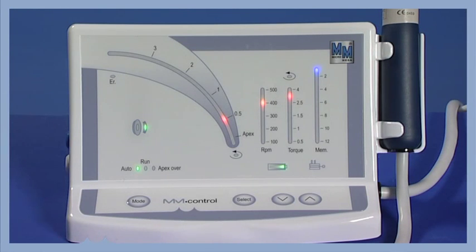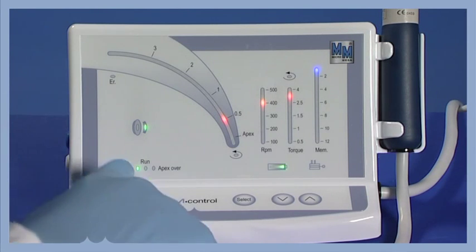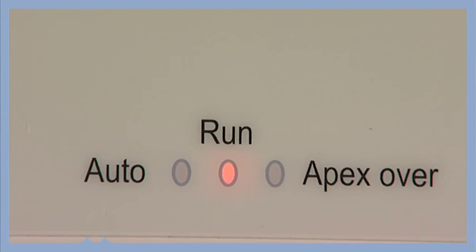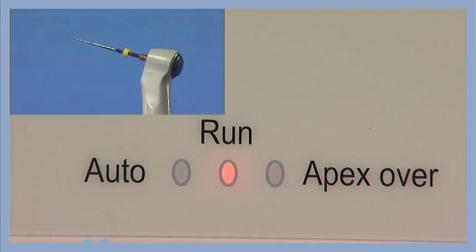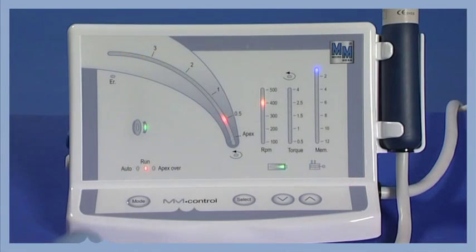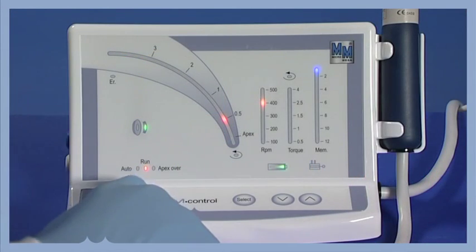If the Run Mode is selected, the file starts immediately. It goes into Auto Reverse when the set torque or apical distance is reached. It stops when the mode button is pressed.